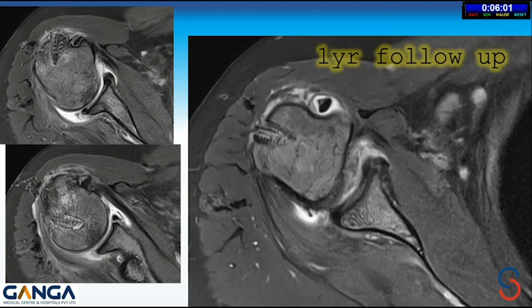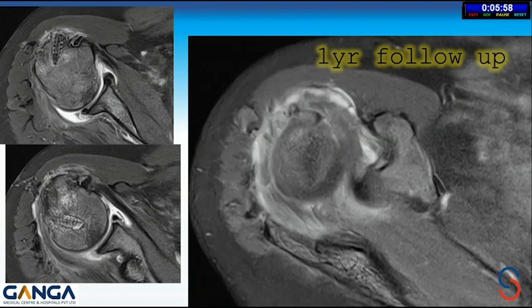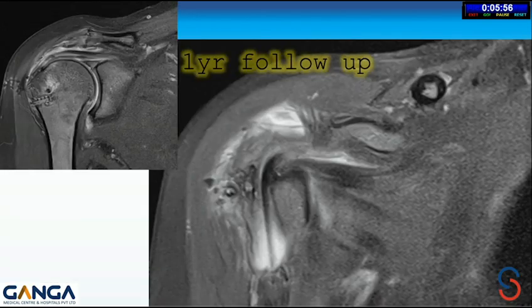Ramakanth, this kind of tear pattern seems to be tailor-made for a patch. Did it ever cross your mind to put a sandwich in between the two layers? No, actually this was a surprise, because I had a pre-op MRI which showed a regular cuff tear, and it was a completely intraoperative surprise for me, so I never prepared for any patch. I just thought that on the table it's good collagen tissue to preserve. So we just need some bite into the tissue, and then we need that compression. So the double row suture bridge was planned intraoperatively.